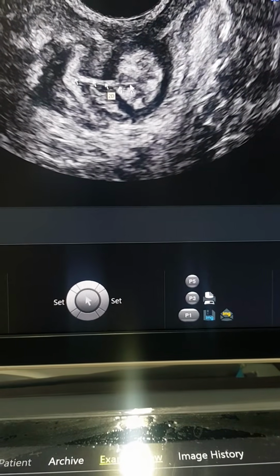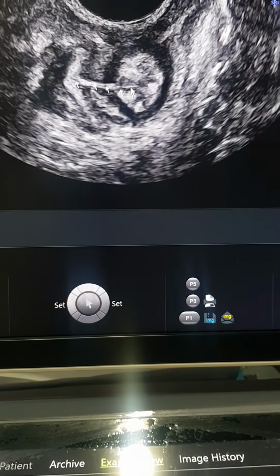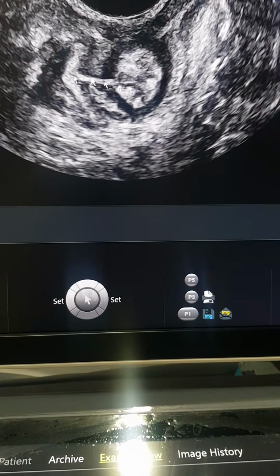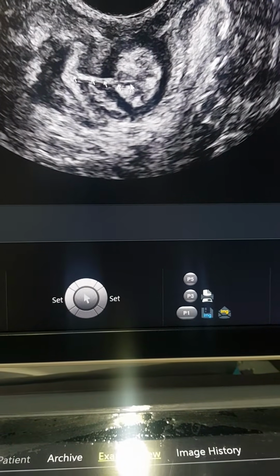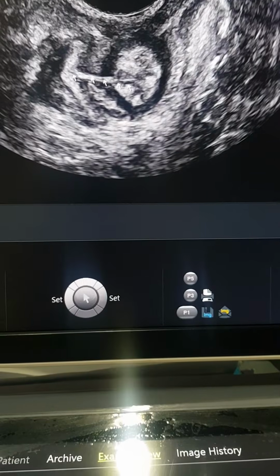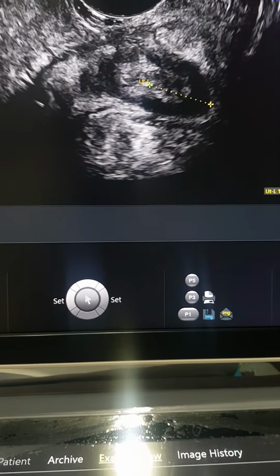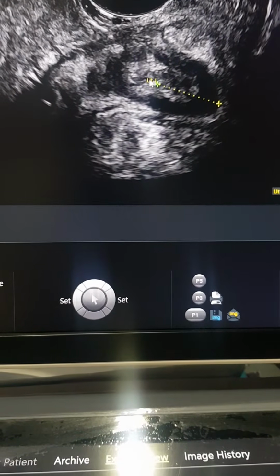On interrogation with the patient, we realized that it was a medicated thread which was introduced from below the skin, and this is the upper end of the medicated thread in the anal canal. So the thread has traveled through the entire part of the fistula, which makes it very easy for us to study this case.